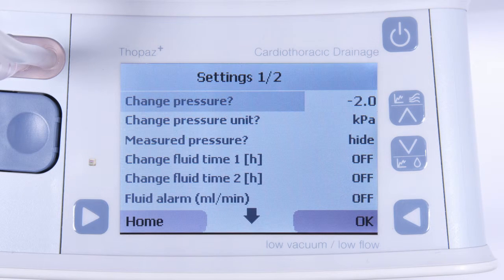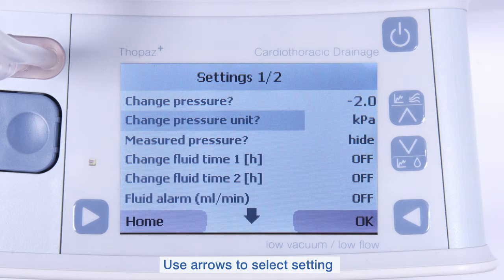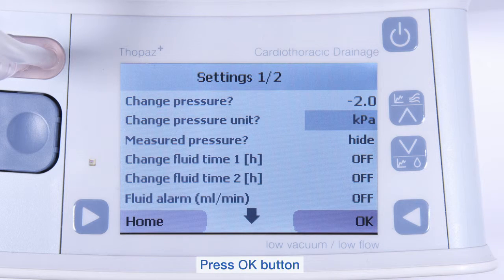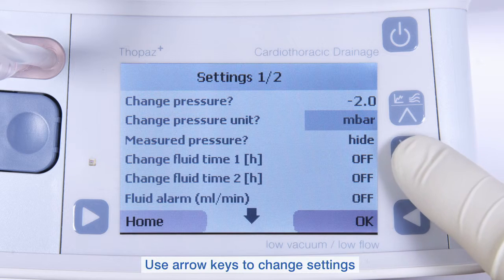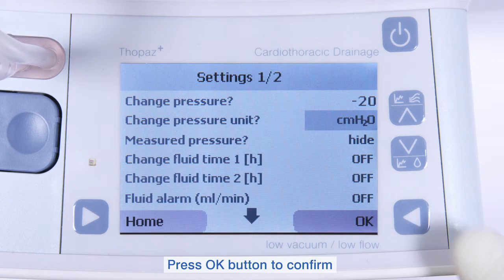Once in the settings menu, use the arrow buttons to highlight the settings you would like to change, and press the OK button to select. Press the up-down arrow buttons to select the desired value, and press the OK button to confirm.